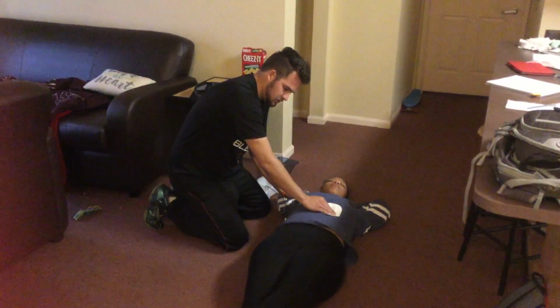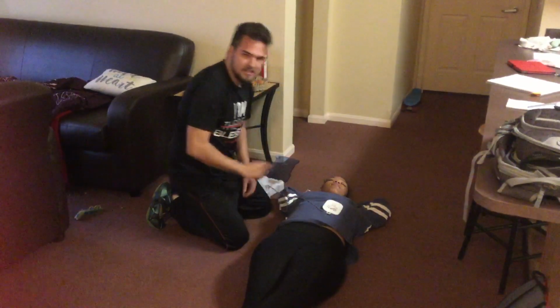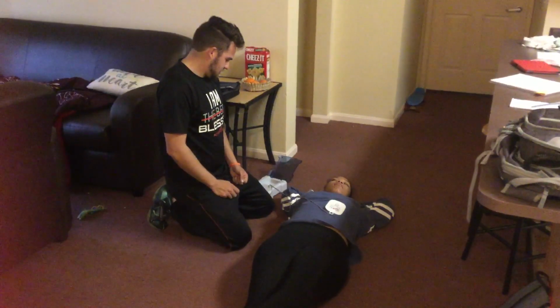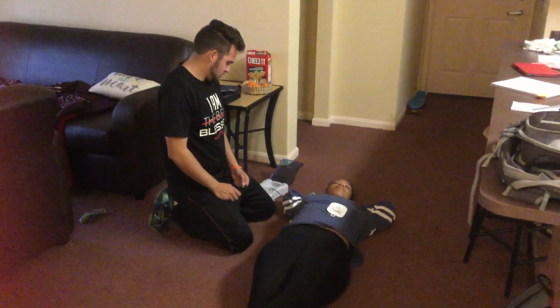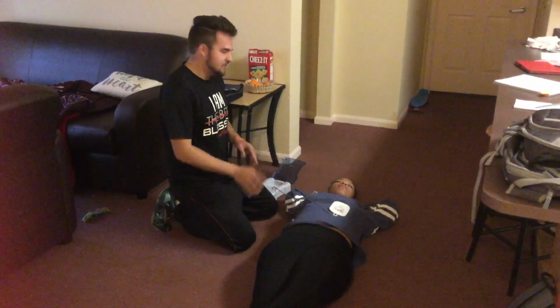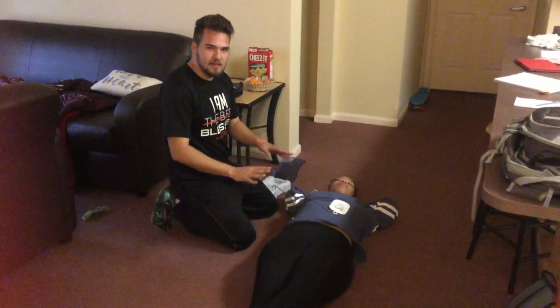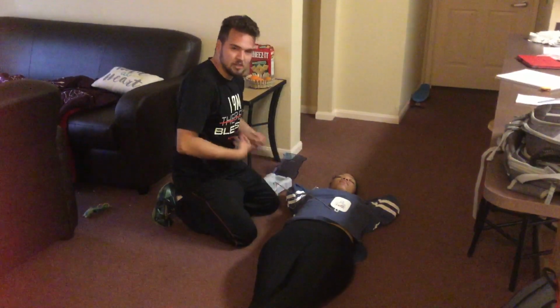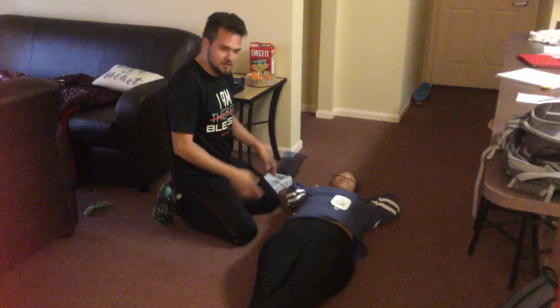Do not touch the patient. And right here, you don't touch them, because it's analyzing that heart rhythm. You don't want to change that heart rhythm at all. Do not touch the patient. Analyzing heart rhythm. Shock advised. Do not touch. So at this point, if shock is advised, have everybody clear out of the way that you have aiding you. Make sure everybody's out of the way, including me, and hit the shock. Shock will be delivered right there.